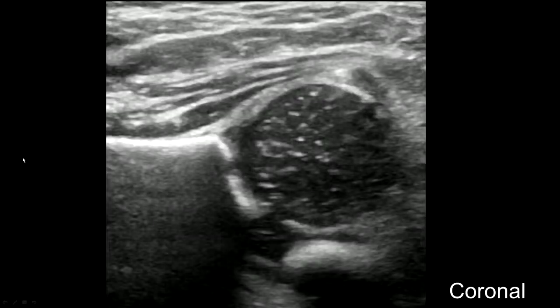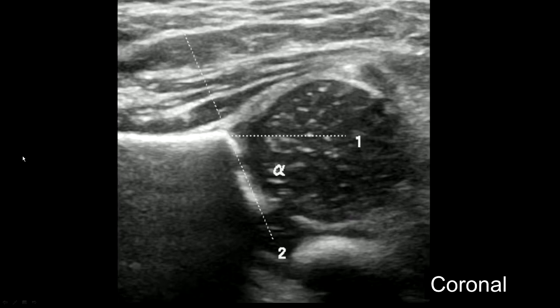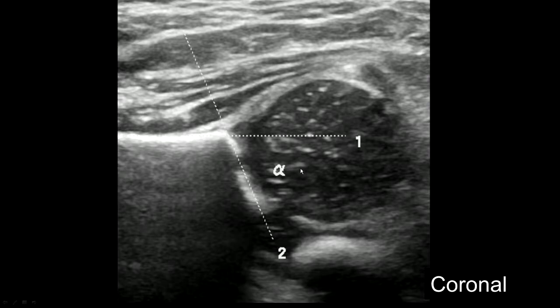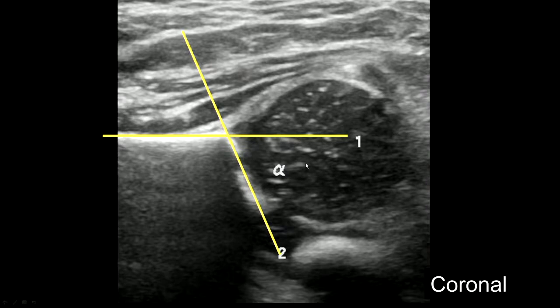On the coronal view, we can see the acetabular roof and the iliac wing. It's important that the line through the iliac wing should bisect the femoral head — this is called the equator sign. The two lines form the alpha angle, which should be 60 degrees or more.